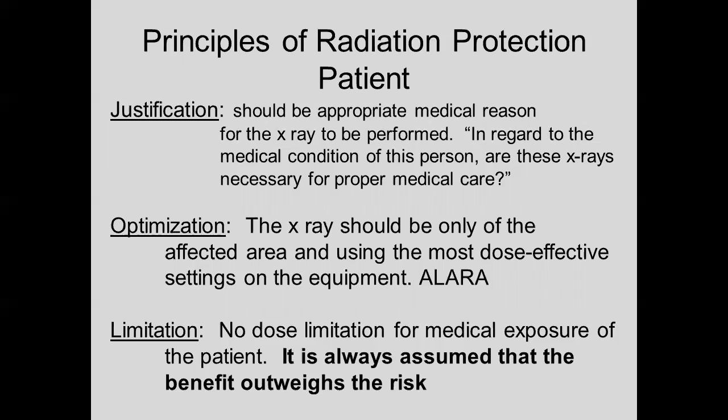At some point, if you're in a complex case and you're at 10 gray, is it worth the risk of getting a skin burn to continue going? Okay. Now, if you just took a break and brought it back a month later, those doses are considered additive. You'd have to take a couple of years off before they really consider it not additive. Okay. So those are things you have to think about. Can you switch to a different angle? Things like that. What can you do to get radiation off that one?